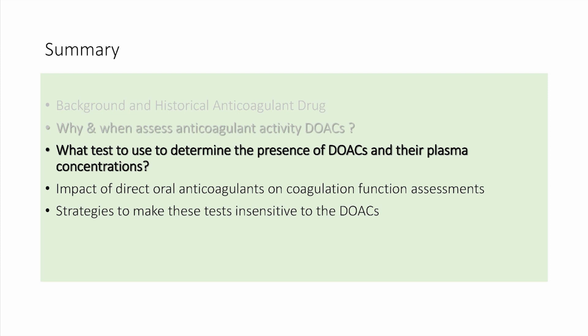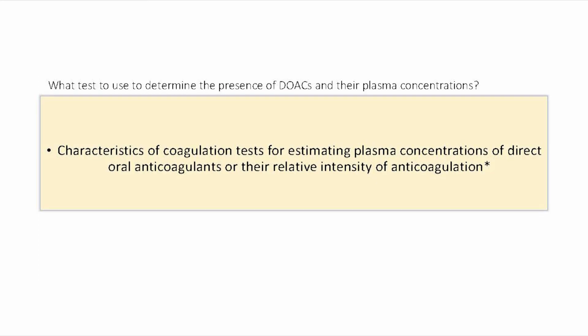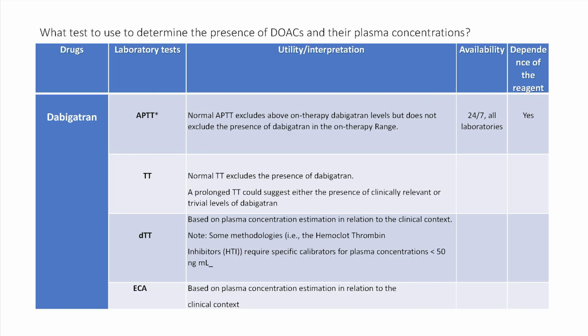What tests have the potential to be used for assessing direct oral anticoagulants? In dabigatran, the APTT can be used.